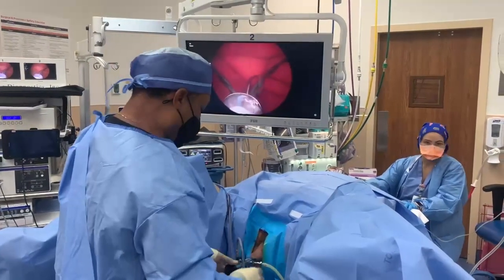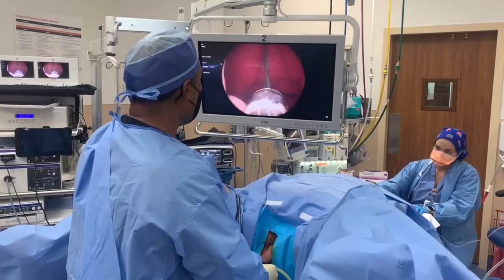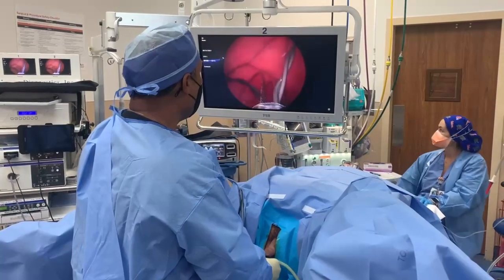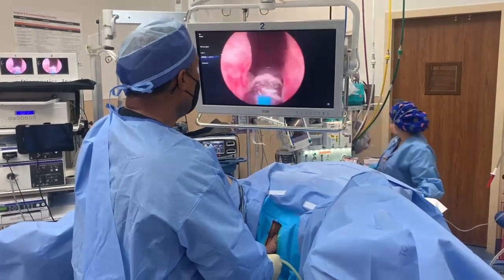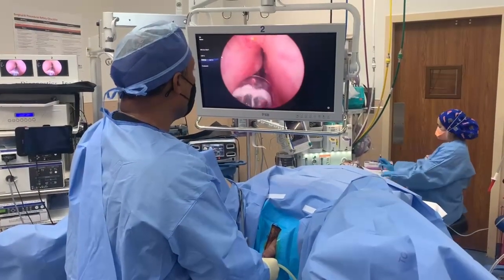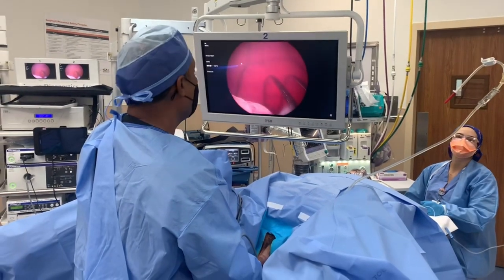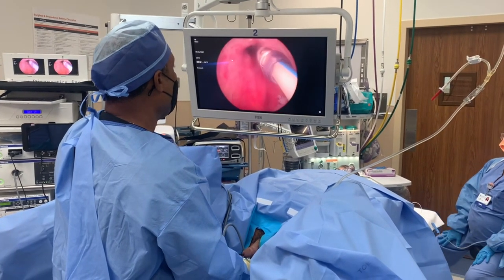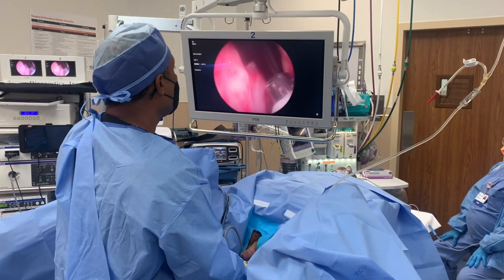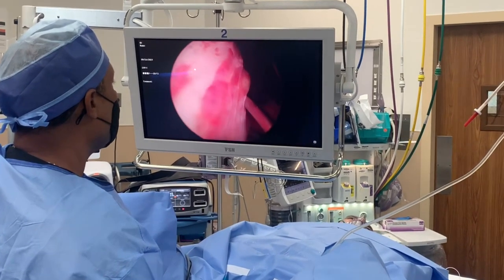Now you can see the device in the bladder itself. I can rotate it from side to side, but this tongue or lip that we have here — we want that in the six o'clock position. So we're going to come back and place this within the prostate itself. We're going to deploy the cage — as you can see this gentleman has a high bladder neck here — and so we're going to pull this back into the prostatic channel and sit at the base of the bladder neck.